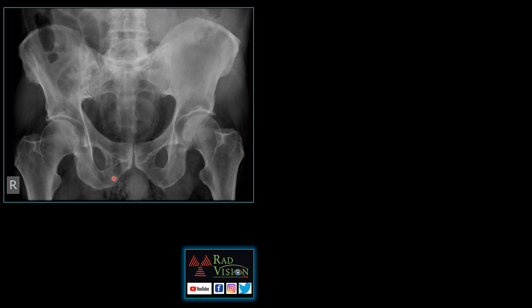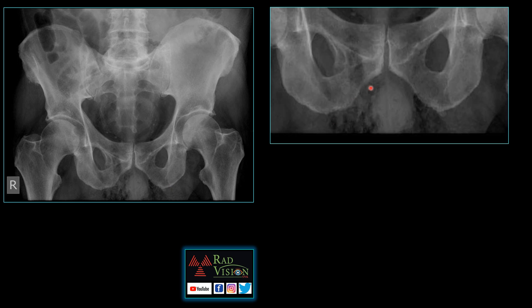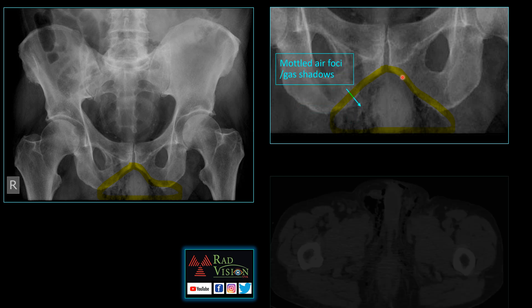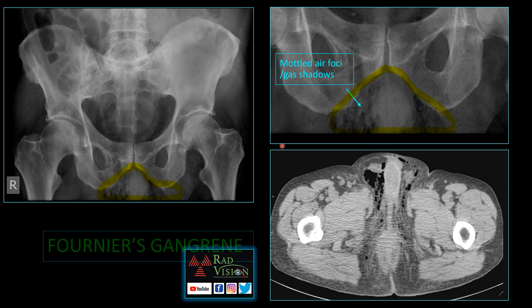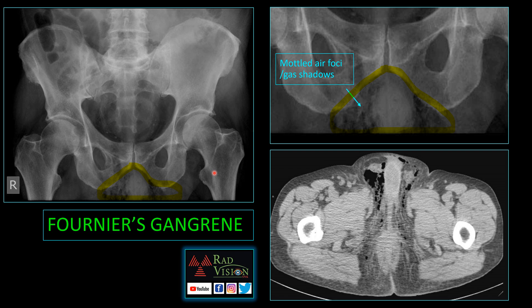Here you can clearly see there are multiple mottled air foci noted in the scrotum. Multiple air foci are noted in the scrotum in a diabetic, even extending along the soft tissues of the pelvis. The diagnosis is a classical case of Fournier's gangrene.